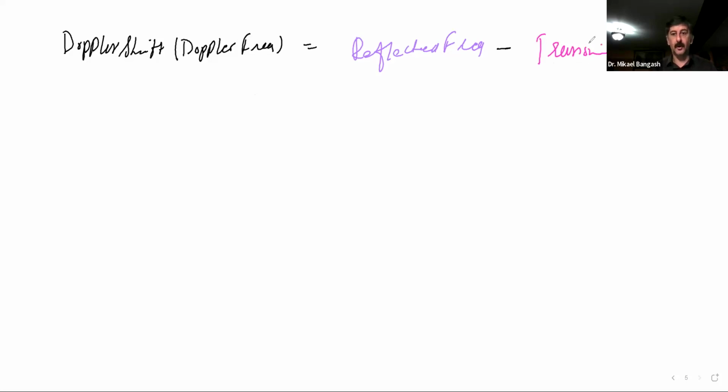Your transmitted frequency is mainly just the frequency of the transducer. Clear?